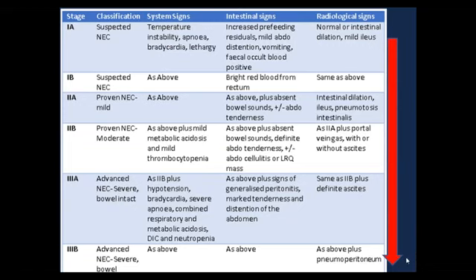And again, according to Bell's classification, based on the clinical impression and the X-ray only, the impression was just stage 1A or stage 1B at the maximum, but after ultrasound, the impression moved to the bottom, stage 3B.